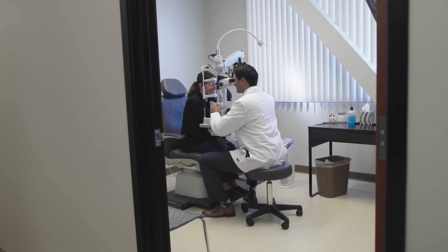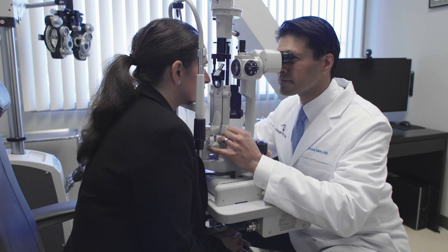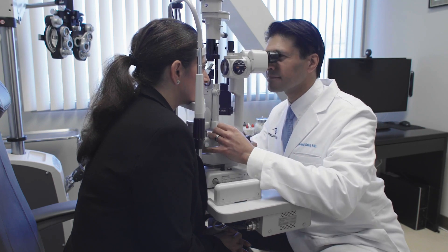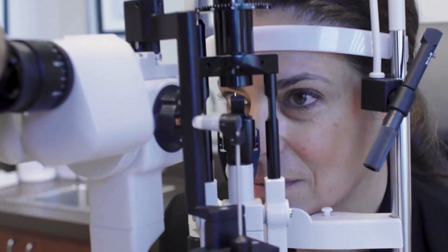I have a TopCon slit lamp that is over 20, maybe 25 years old, and I also have one of the newest slit lamps that I purchased this last year. Like so many of the themes we see with TopCon, it is the quality, it is the ease of use, it is reliability. Very much a price point that's fair to practices, which I think is very important.